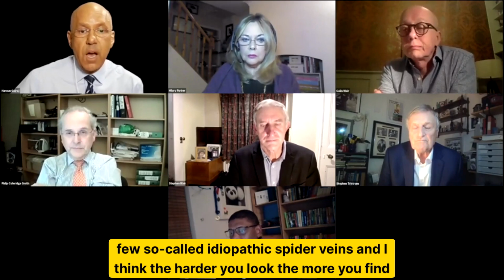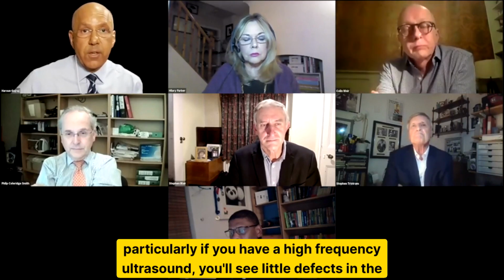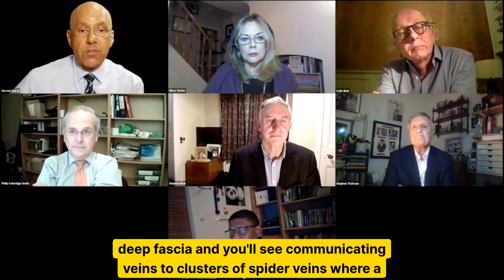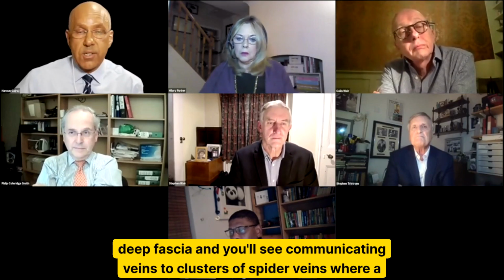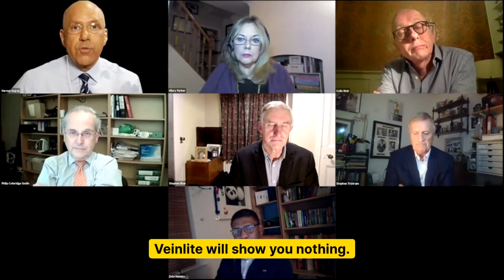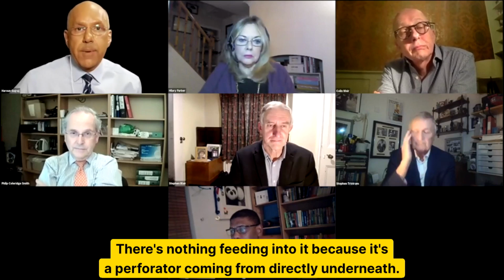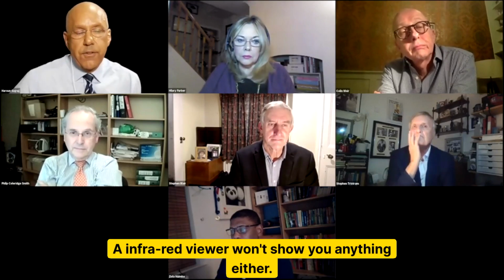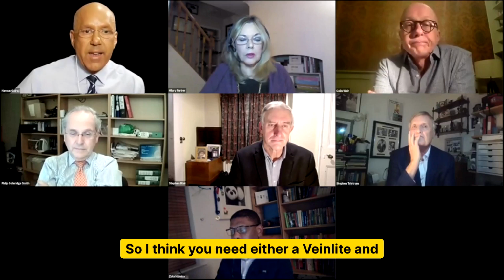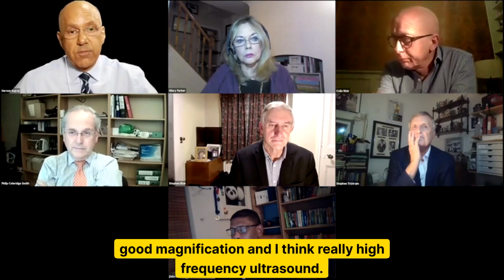And the harder you look, the more you find reasons, particularly if you have a high frequency ultrasound. You'll see little defects in the deep fascia, and you'll see communicating veins to clusters of spider veins where a vein light will show you nothing. There's nothing feeding into it because it's a perforator coming from directly underneath. An infrared viewer won't show you anything either. So I think you need either a vein light and good magnification, and I think really high frequency ultrasound.